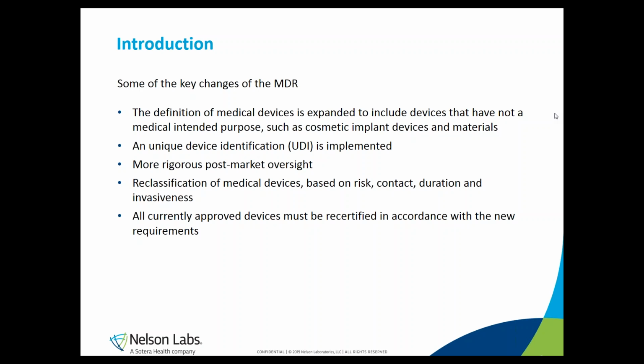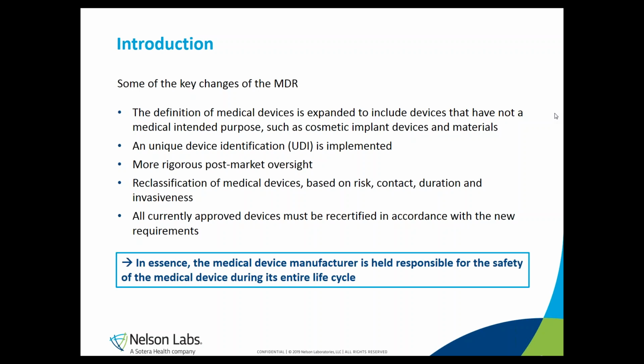Of major importance is also the change in classification of medical devices, which is based on risk, contact, duration, and invasiveness. And finally, a recertification in accordance with the new requirements is mandatory for devices which are already certified under previous regulation. So to summarize, in a sense, the medical device manufacturer will be held responsible for the safety of the medical device during its entire life cycle, meaning from the first use until the end of life of the device.